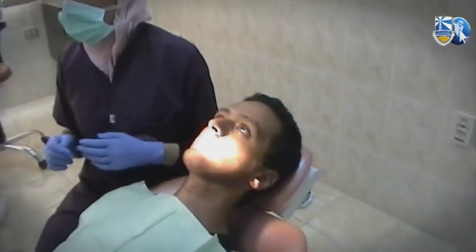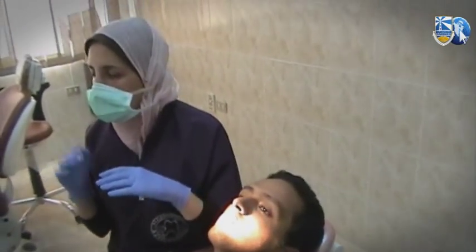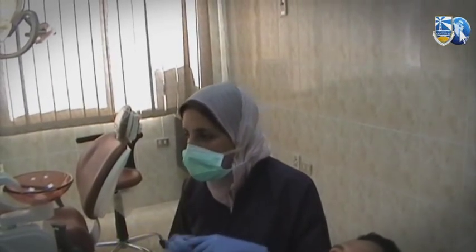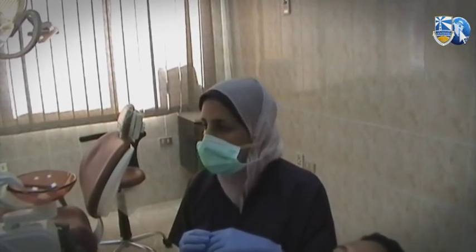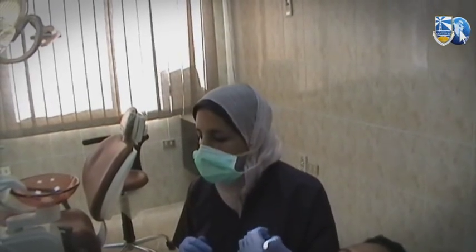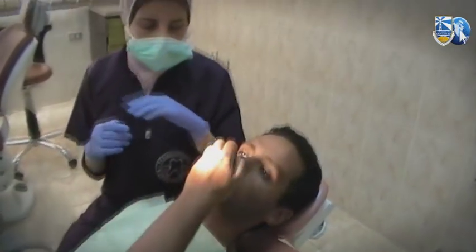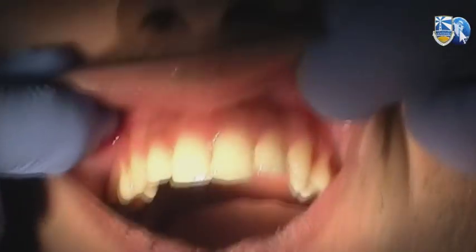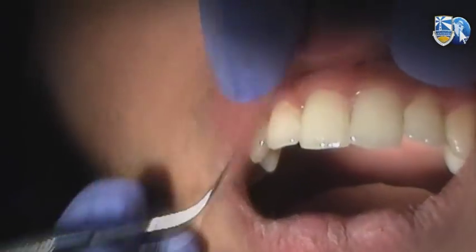The next item is the size of the gingiva. The normal size: the margin of the gingiva will be one millimeter coronal to the cemento-enamel junction, and the interdental papillae will be confined to the interdental triangle. The abnormal would be the marginal gingiva covering more than the cervical third of the crown, or the interdental papillae extending out of the interdental triangle and covering part of the crown. Here, on this patient, we do not have any increase in size. We see the margins are normally in place and the interdental papillae are confined to the interdental triangle.